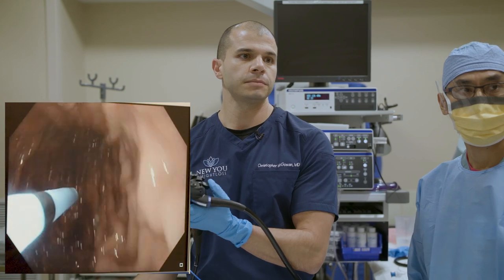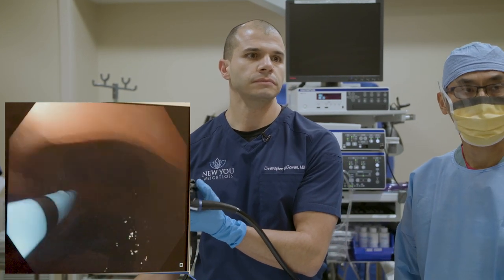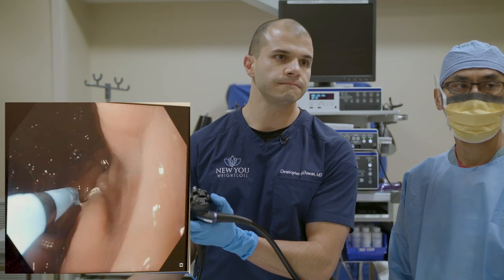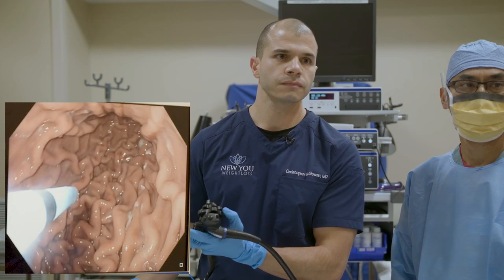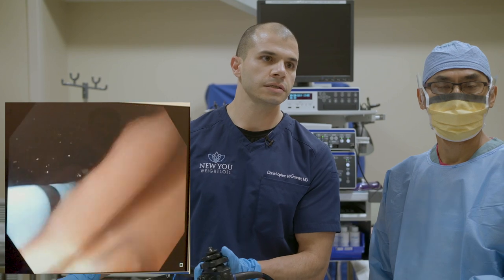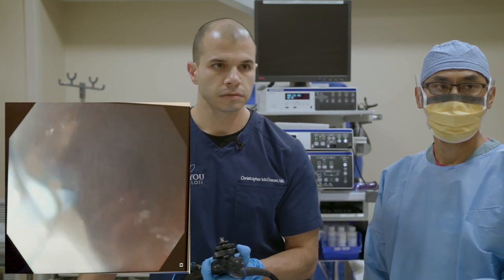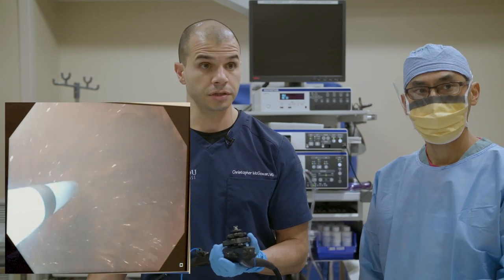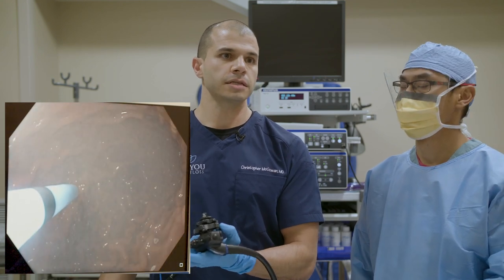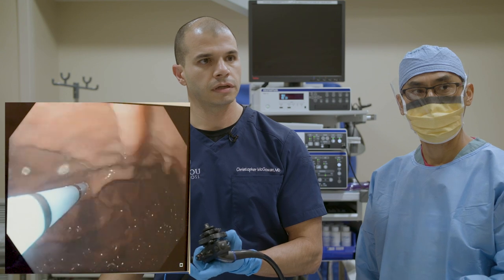We're going to mark the back wall of the stomach and the front wall with a line coming up — I'm placing separate little dots working our way up. This will guide us during the procedure. The stomach is nice and normal, with somewhat prominent folds, which is within normal. We're reducing the diameter of the stomach by approximately 80%. I'll also make a third line coming across at the top — that marks the upper boundary of where we'll suture.